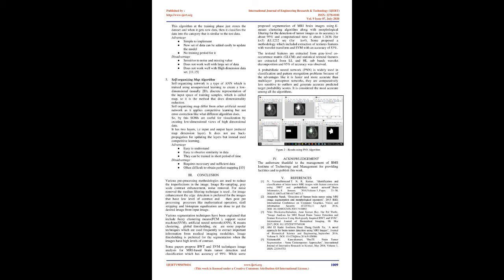Advantage: ability to solve more complex representations. Good for making the network deeper. Disadvantage: prone to overfitting. Takes more time.